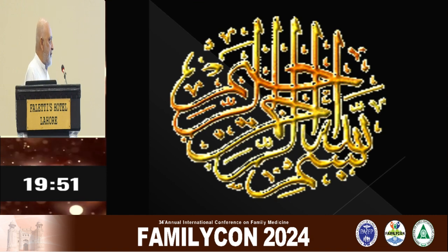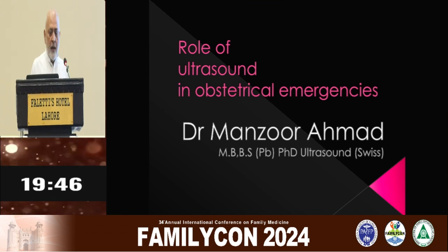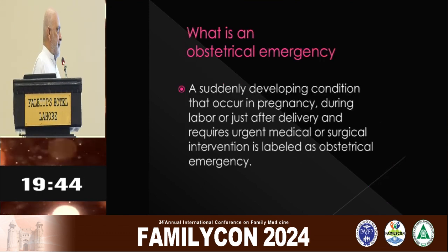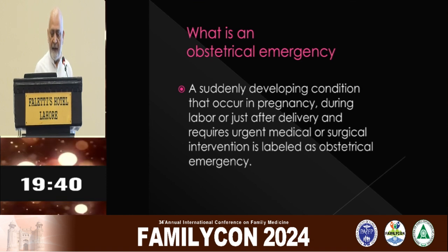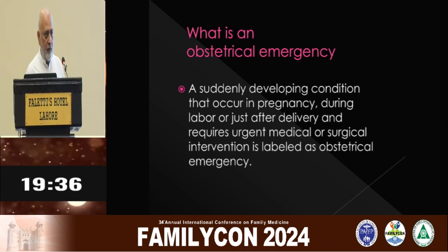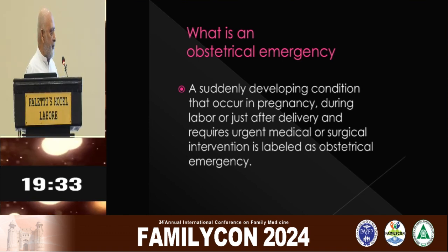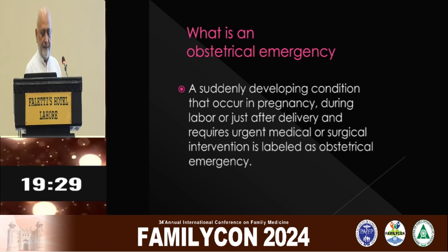So my topic of discussion is the role of ultrasound in obstetrical emergencies. And what is an obstetrical emergency? A suddenly developing condition that occurs in pregnancy, during labor, or just after delivery, and requires urgent medical or surgical intervention, that is labeled as obstetrical emergency.